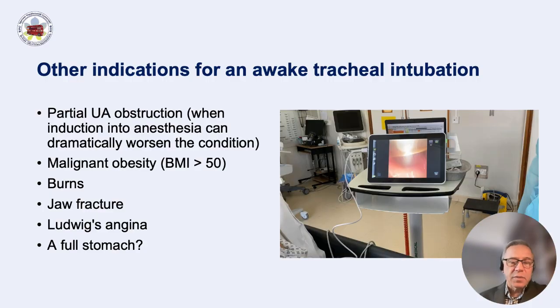Now you can see that this patient is partially obstructed and there's virtually no room there. So putting this patient off to sleep will completely obstruct him, and you may not be able to ventilate him at all. Now, whether you will be able to fiber optically intubate this patient is another matter. And for this patient, I will probably choose something a bit more exciting, something like a Tritube, which is a really small, interesting tube that we've been using with a specific Ventrain ventilator.